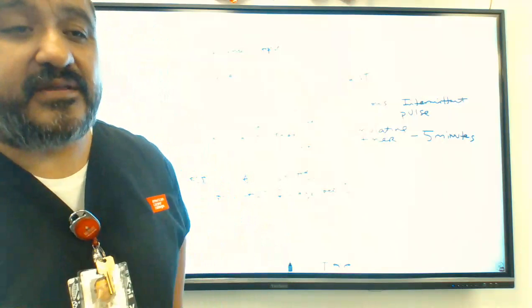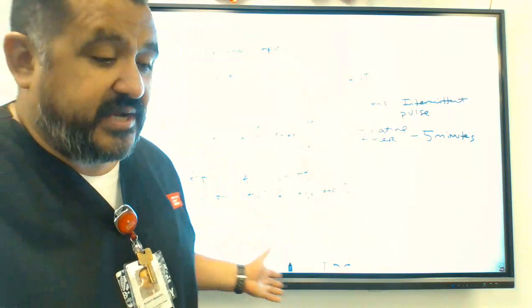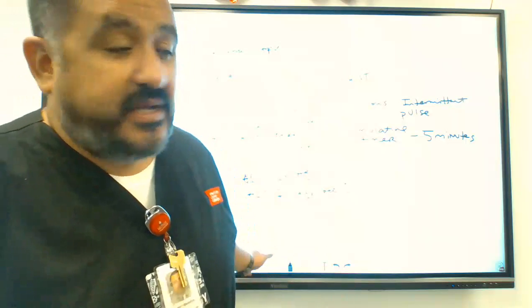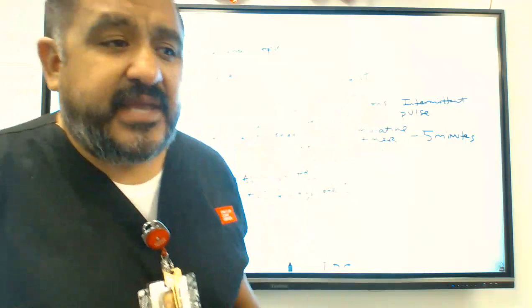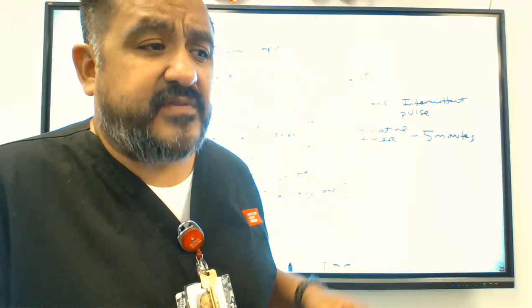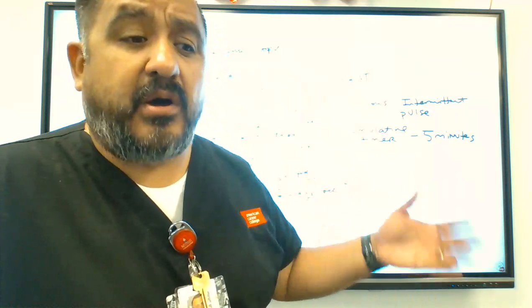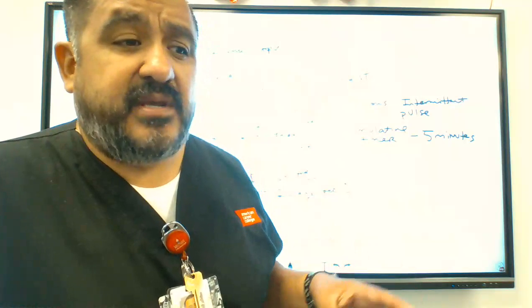And you're going to find out that in your reading, it says that fluoroscopic systems, with the use of last image hold, intermittent pulse, and ABC, help to reduce time as well, because you don't have to let the exam be as long. Because we're getting the images faster, you're getting less dose, right?